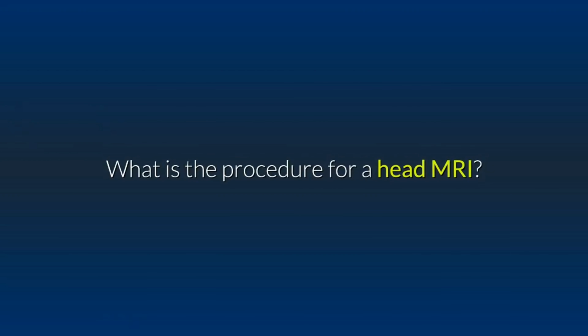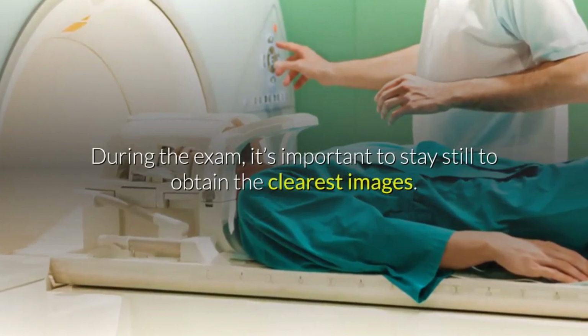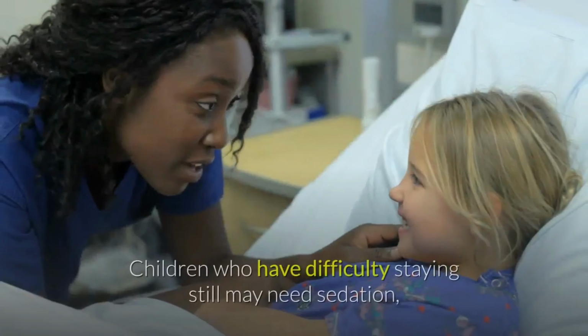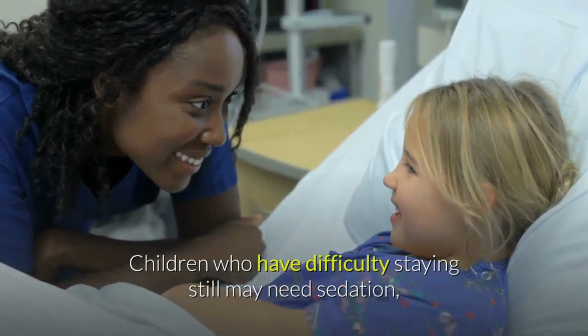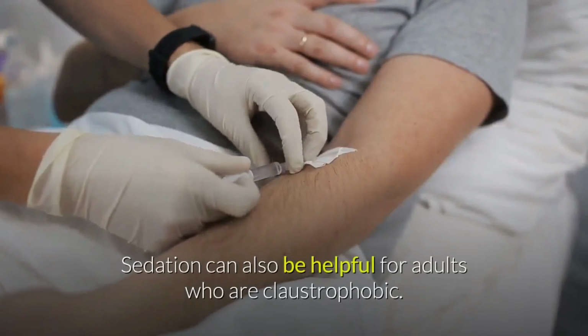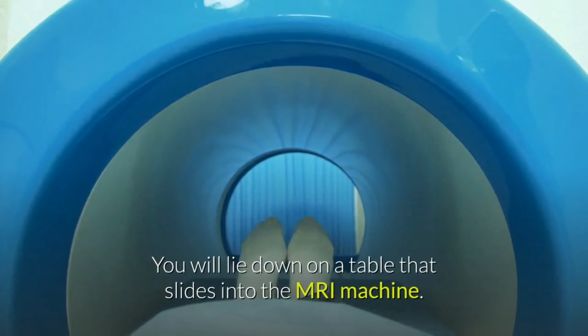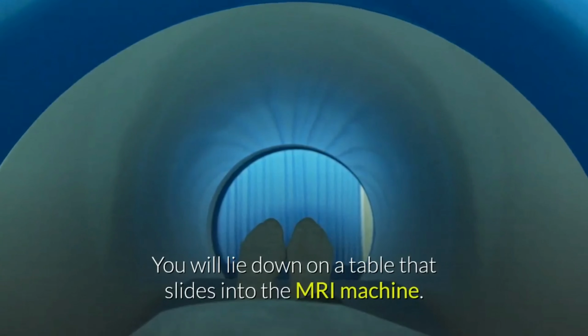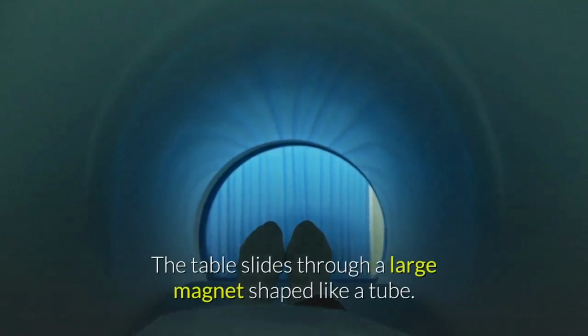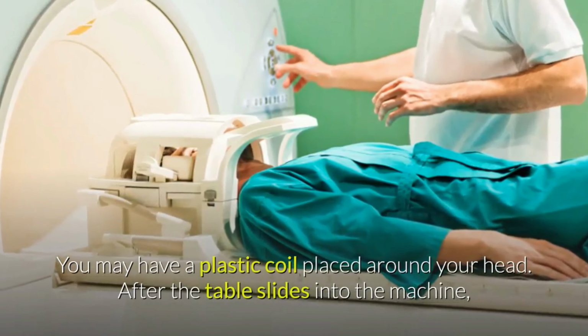What is the procedure for a head MRI? During the exam, it's important to stay still to obtain the clearest images. Children who have difficulty staying still may need sedation, administered either orally or through an IV line. Sedation can also be helpful for adults who are claustrophobic. You will lie down on a table that slides into the MRI machine. The table slides through a large magnet shaped like a tube. You may have a plastic coil placed around your head.